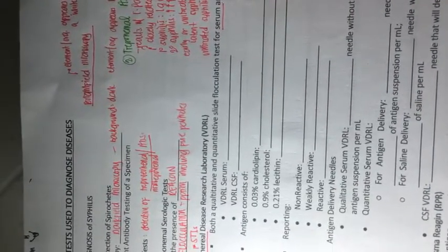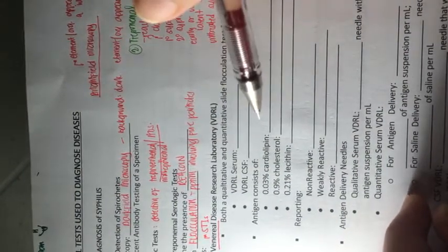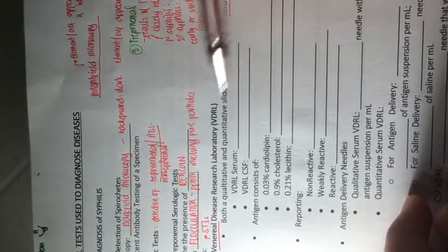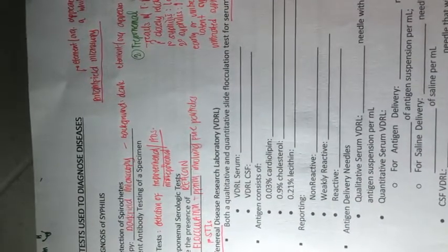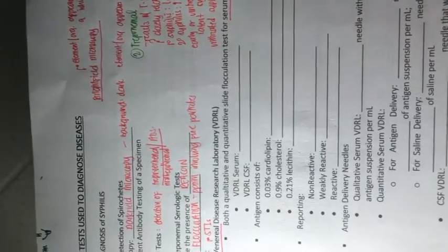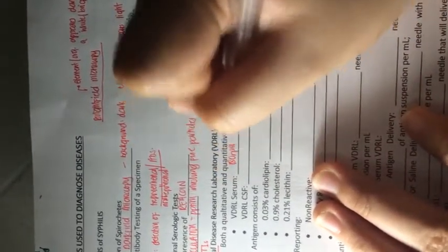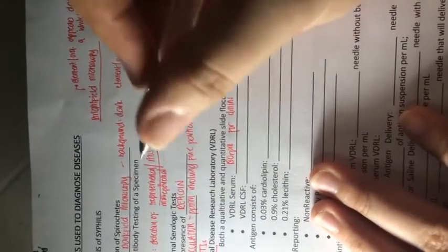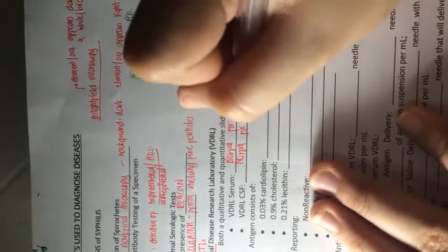For VDRL serum, remember that when performing qualitative tests, upon the addition of serum, and after that we add our reagent, we mix them together, and then we perform rotation for a number of minutes, and after that we should observe for the presence of any flocculation. For VDRL serum, the rotation would be 180 RPM, and it should be rotated for 4 minutes. As for your VDRL CSF, it should be rotated at 180 RPM for 8 minutes.